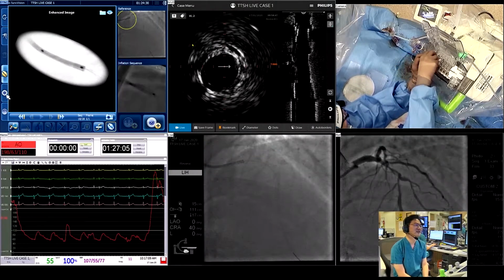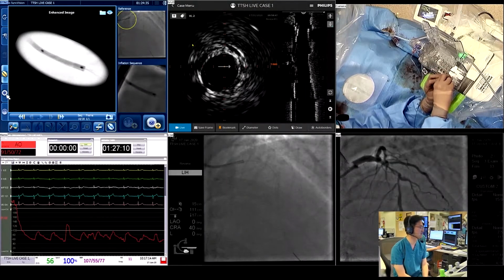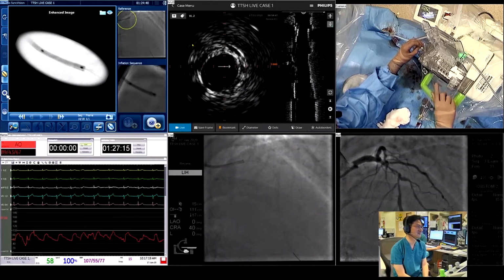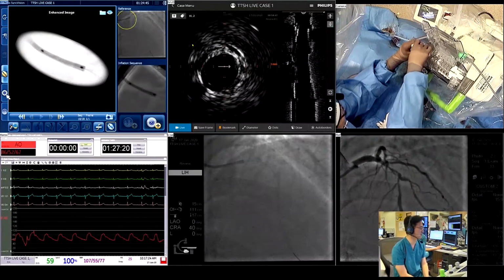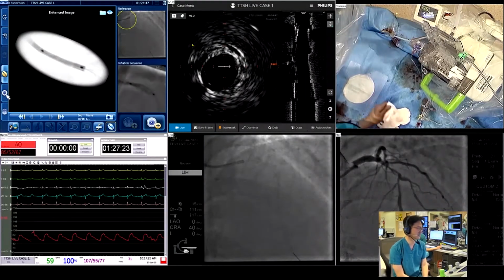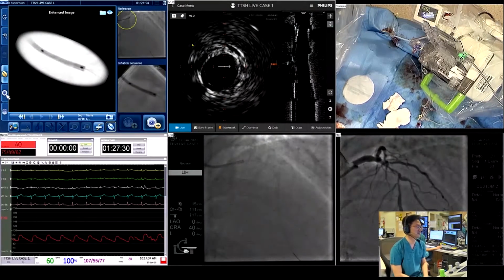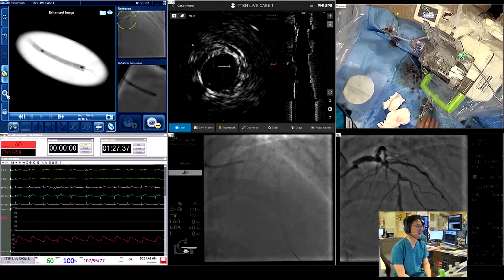Paul, is it feasible? Blood pressure is a bit low, so yeah, go on. Is it feasible to do this angioplasty with just the radiographer and a nurse being there inside who can load and reload rather than your colleague? Correct. You are absolutely right. That's the ultimate game plan, because all the fellows want to be outside and don't want to be inside. So this is what we are aiming to achieve. Hui Min can actually do some of it, but I wouldn't want to put her through all the stress to do this during a live transmission.